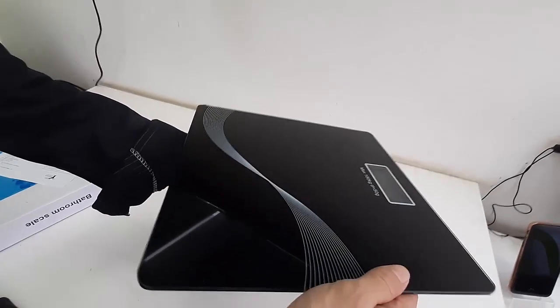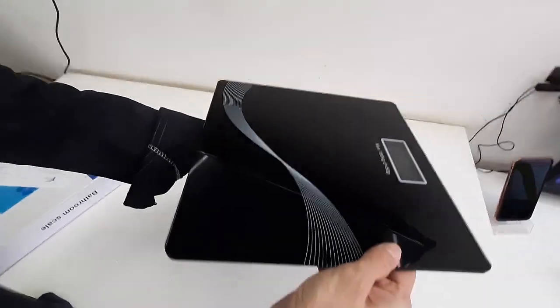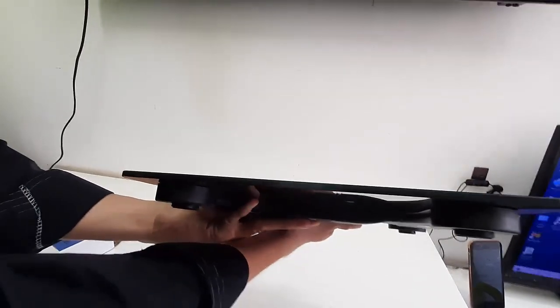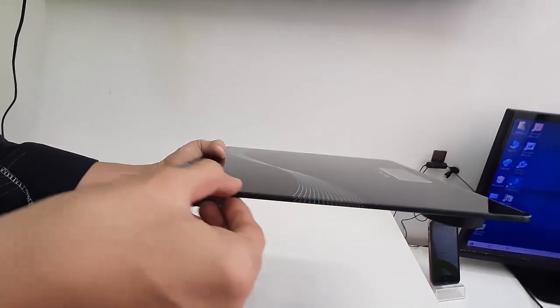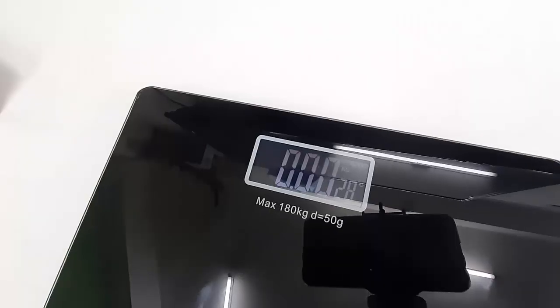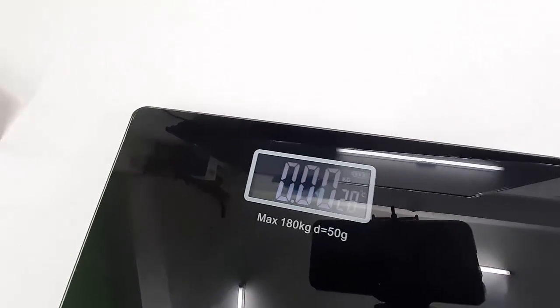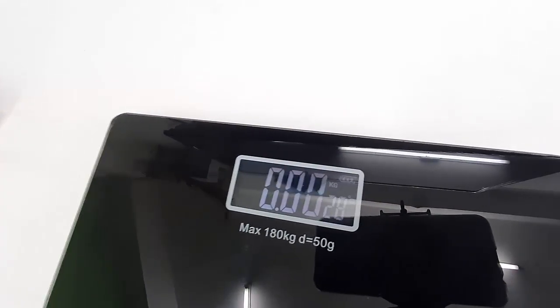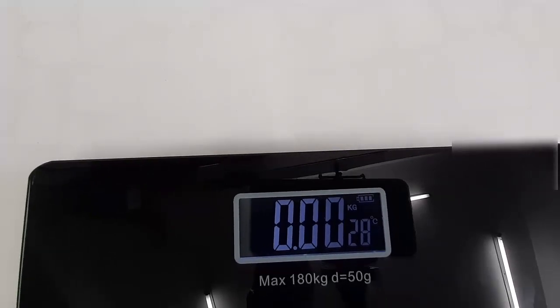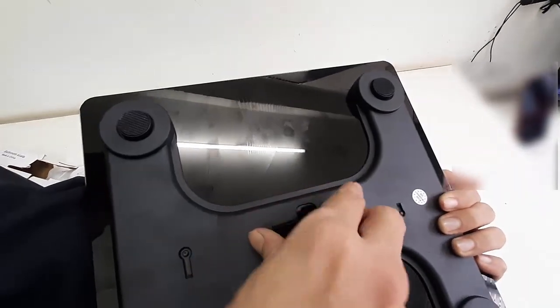This is a lightweight and very slim machine — the design, build quality, and look are very nice. On the display you get weight measurement, room temperature, and battery indication. The maximum user weight is 180 kg.